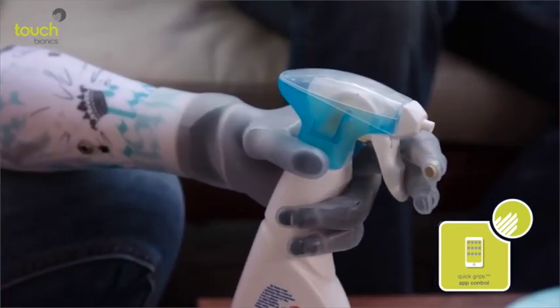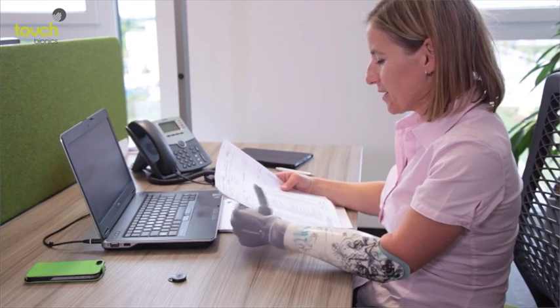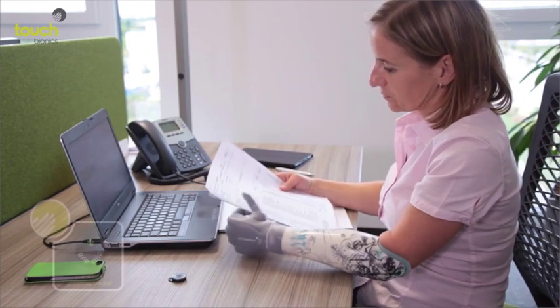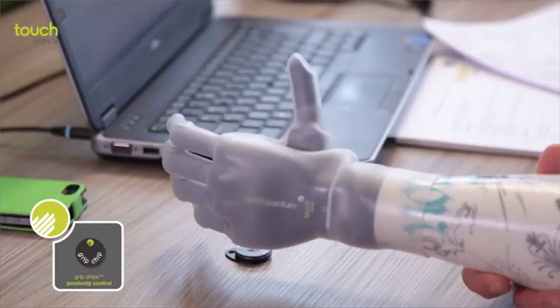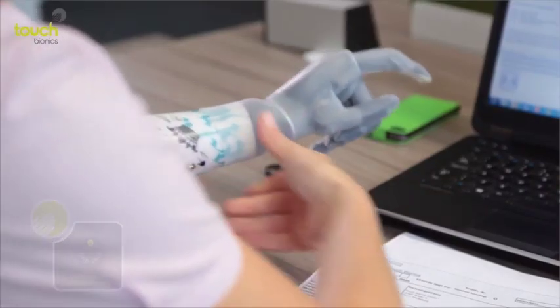So here she's using her app to get into a grip. Use a spray bottle to clean up her little mess that she made. We also have grip chips. That's this little gizmo on the table. She's going to move her hand over that grip chip, and it'll put the hand into an index point so that she can use a keyboard to type.